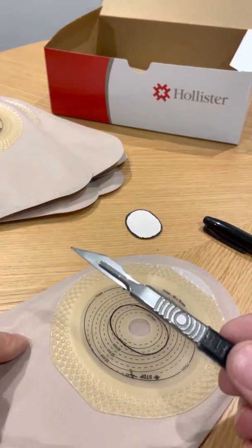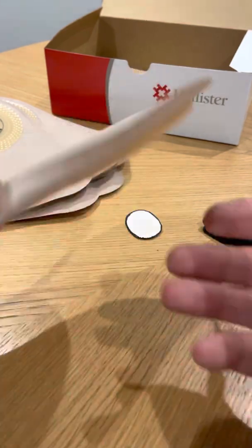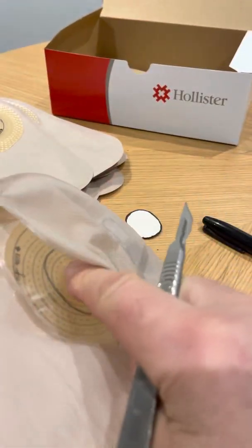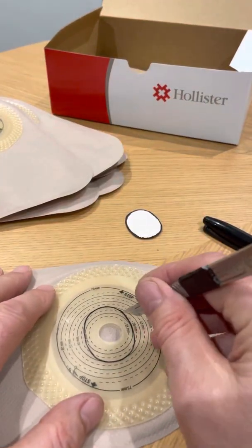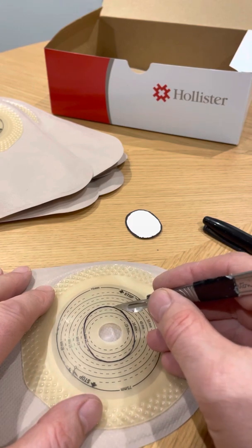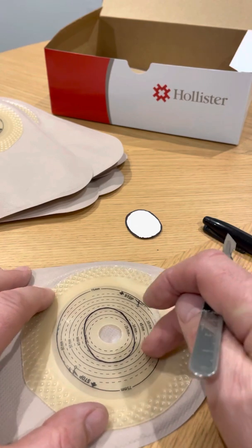And I take a normal scalpel. Now it might seem a bit alarming because you don't want to pierce the thin film inside. That's absolutely vital that you don't pierce that. So one mustn't push too hard with the scalpel. But having said that, it naturally stops cutting when it reaches the membrane on the other side of this gelatinous material.